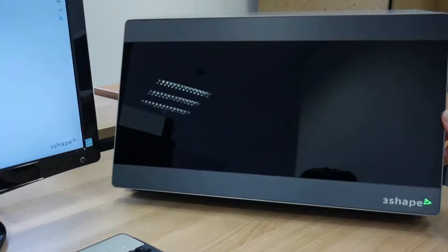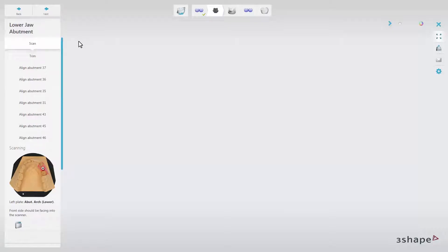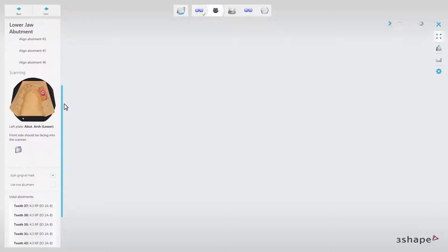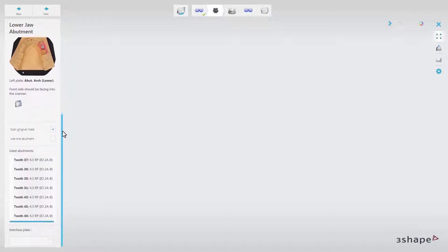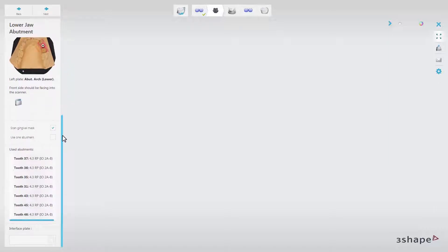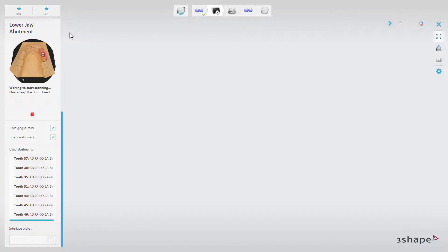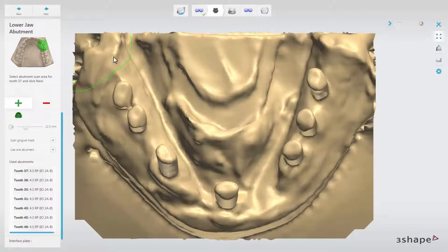It's worth mentioning here that in cases where you have only one scan abutment, which needs to be used to scan all implant replicas in the model, you can choose the option Use One Abutment. In order to use this function, first you will be prompted to screw in the scan abutment, for example, for 237.